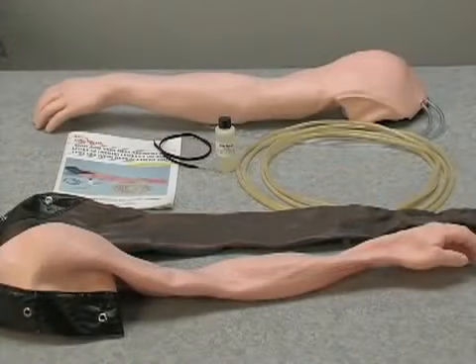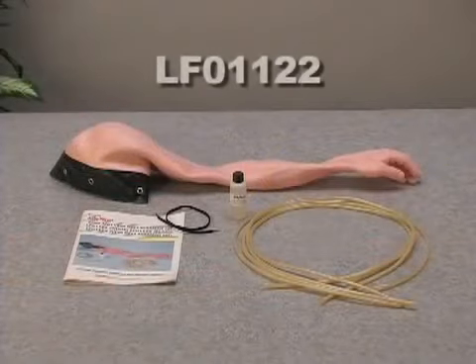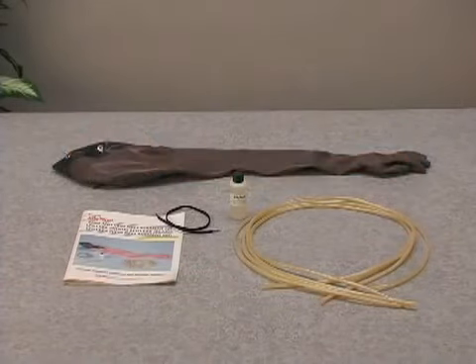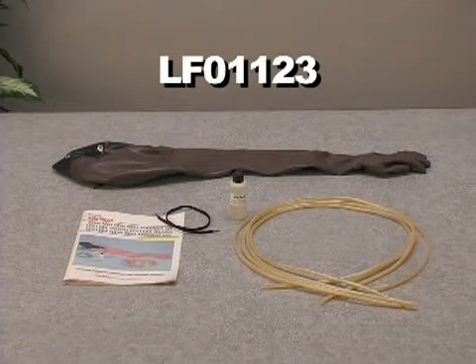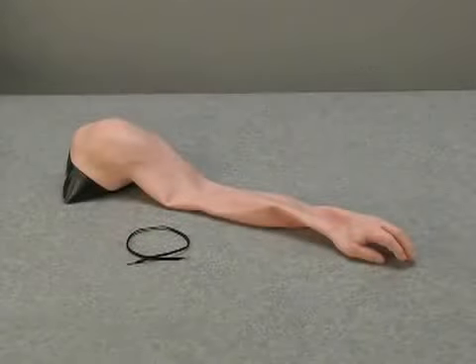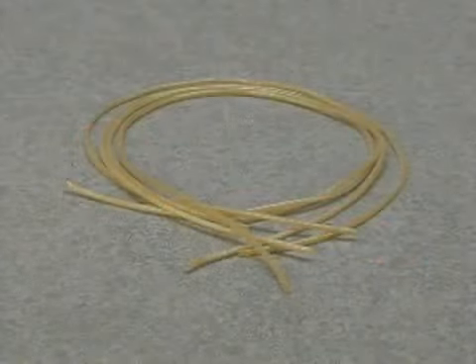There are two options available for purchase: the LF01122 White Skin and Vein Replacement Kit and LF01123 Black Skin and Vein Replacement Kit. The kit comes with everything needed to successfully replace the skin and veins. The kit includes IV arm skin, 4 replacement veins.